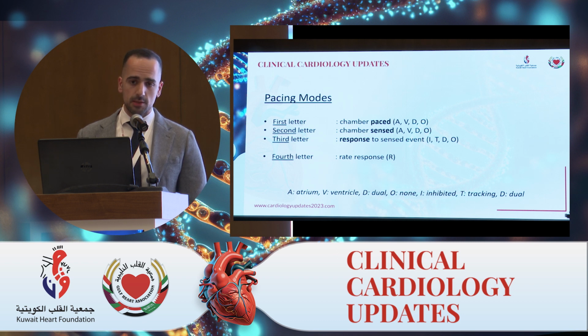Rate response is a feature in the device that tries to predict if the patient is exerting themselves or moving and trying to increase the heart rate to accommodate for that. But when it comes to the first three letters, VVI, for instance, chamber paced is the ventricle, chamber sensed is the ventricle, and the response to ventricular sensing is inhibition. So VVI pacing is pure backup pacing in the ventricle.